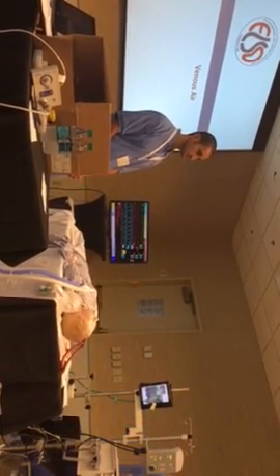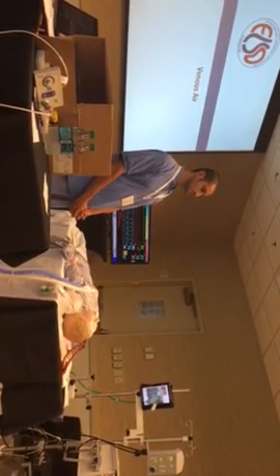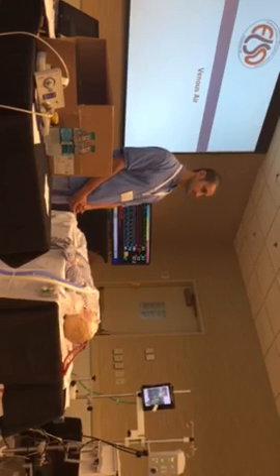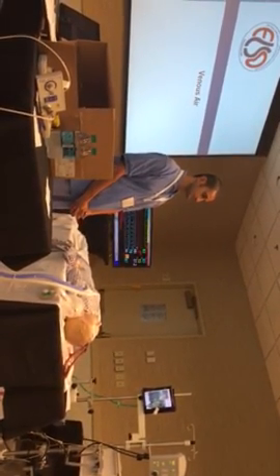And then, okay, without knowing that, my perspective was, okay, we can try and manage the error by having the cap off. But have we actually solved the problem just by readjusting the catheter? Because you were right, if we took the error away, the problem is still there, it's going to return.